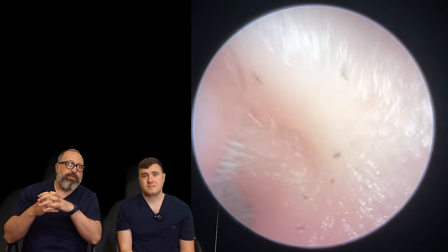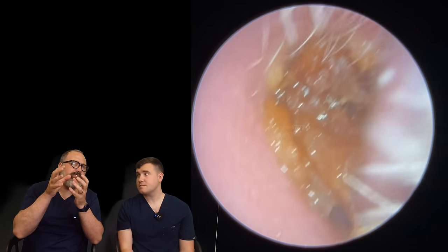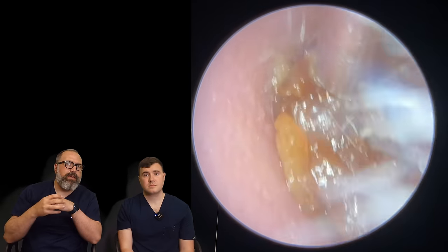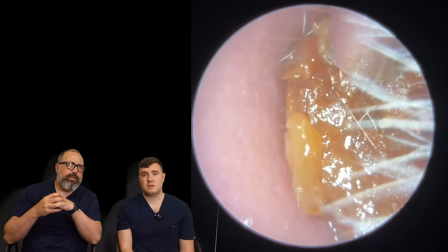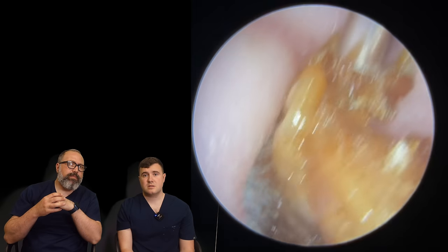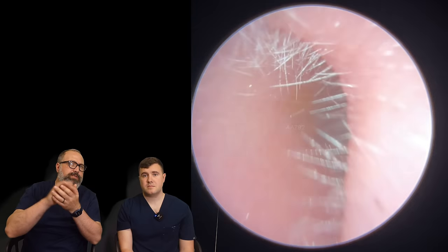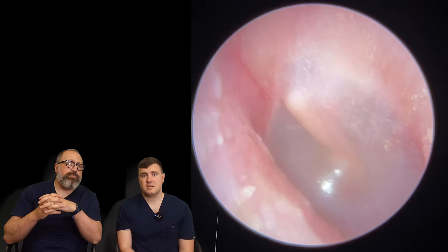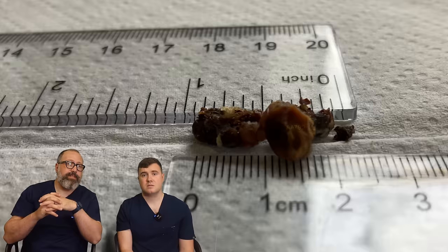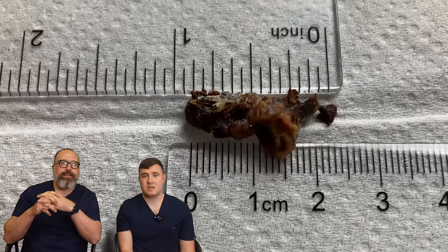Now we see the other side. We've got a very similar situation — no piercing on this side, but this looks more granular, more sort of brittle. It's coming out quite nicely so far, nice and easy. Fingers crossed it'll stay in one piece. There we go — nice big chunky section there as well. That surface is very irregular, which can make it a little bit difficult to get a suction grip. But the eardrum looking absolutely fantastic beyond. So all looking good there. It was nothing compared to Taylor's, but that was about two and a half centimetres worth of chunks of wax — about an inch again.